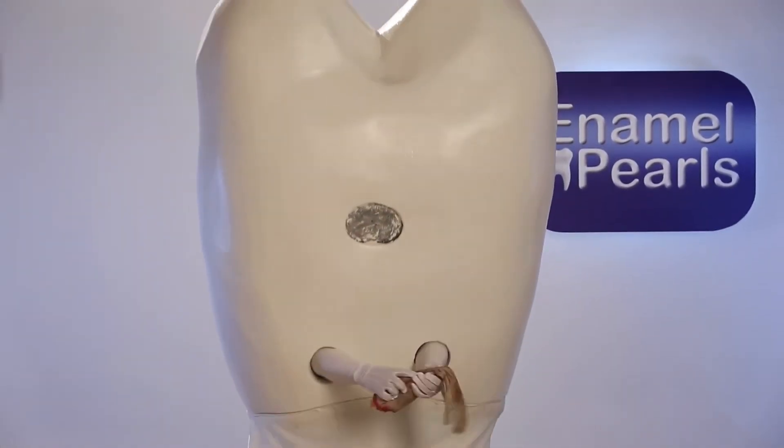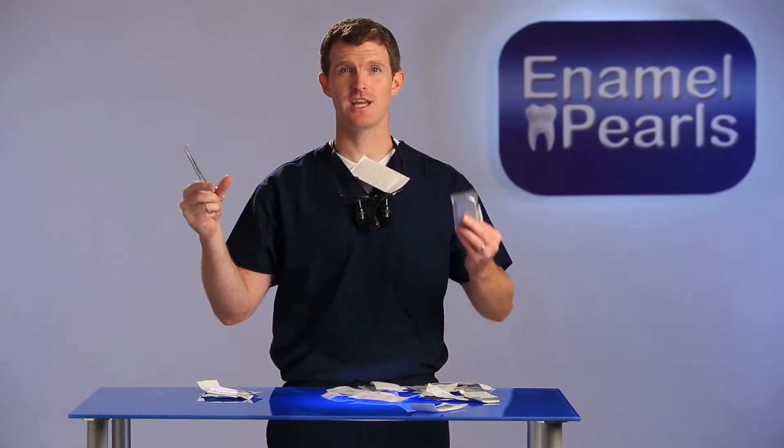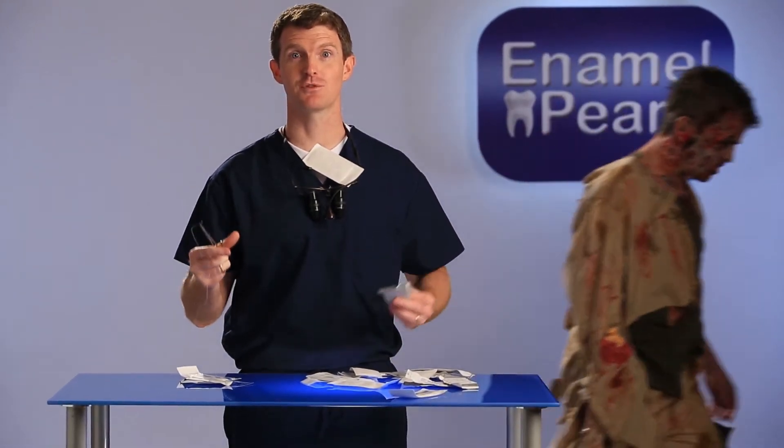Today on Enamel Pearls, I'll show you three important sutures to keep on hand for dental surgery. There are hundreds of combinations of needles, suture material, and suture sizes. So to keep things simple, I'd like to present you with the three sutures that everyone needs on a desert island or in the zombie apocalypse, whichever comes first.